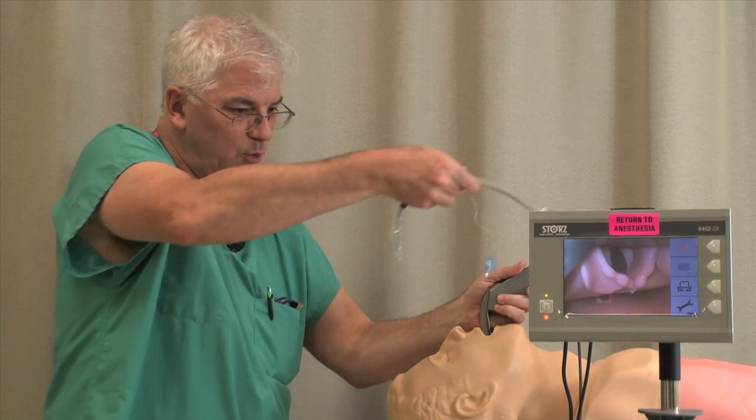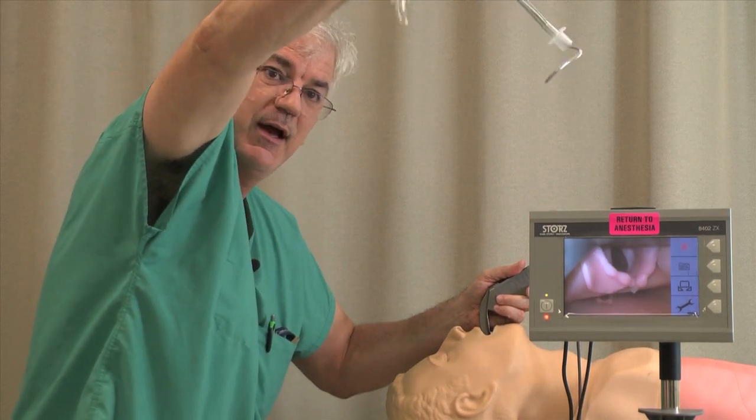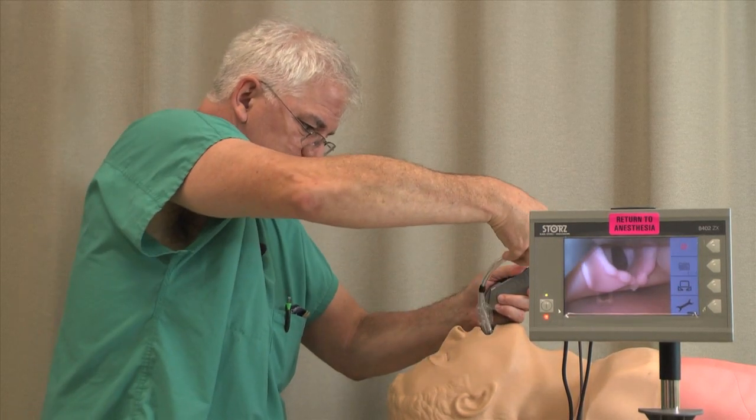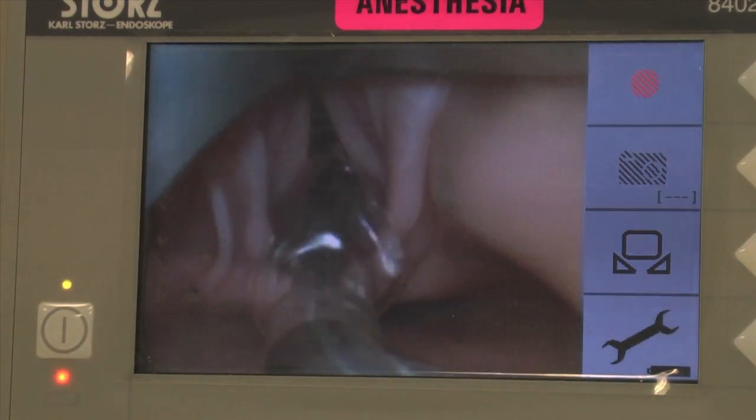Then, with this in more of a C shape, I'm going to C-shape this thing in. I'm going to go just like this. There we go.